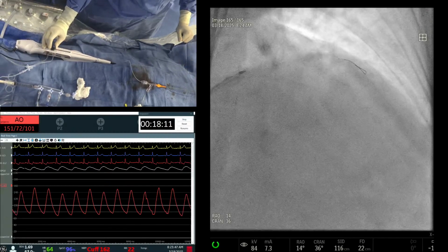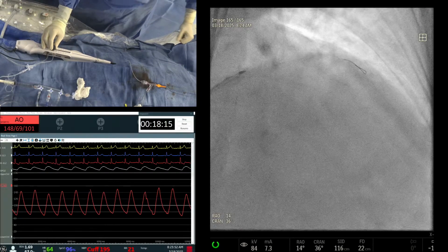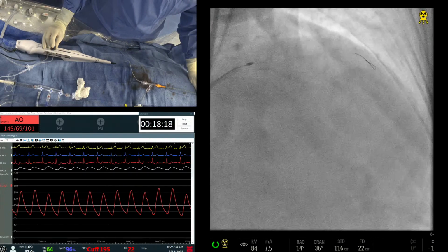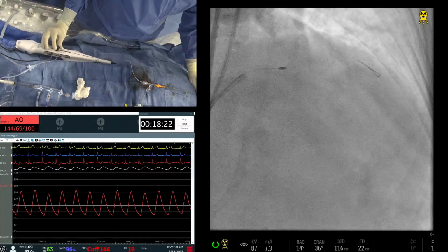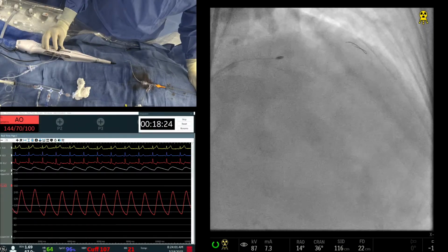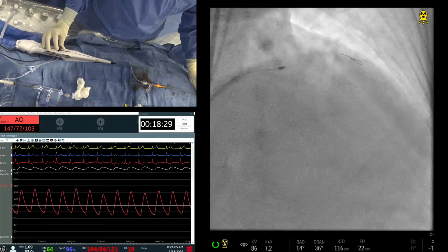A 20-second run, always watching the blood pressure, and then you see the drop in RPM. If it is a 5,000, an empty blue or yellow triangle comes, and if it's more than 10,000, then it becomes a solid yellow triangle. That means you're too fast. You have to cut down slow.